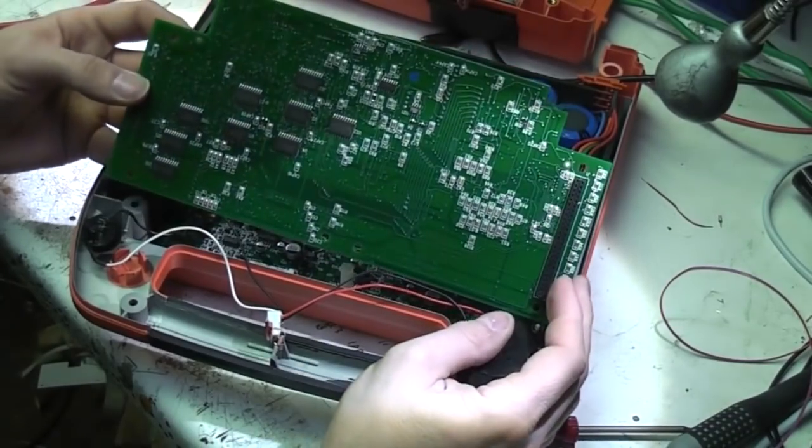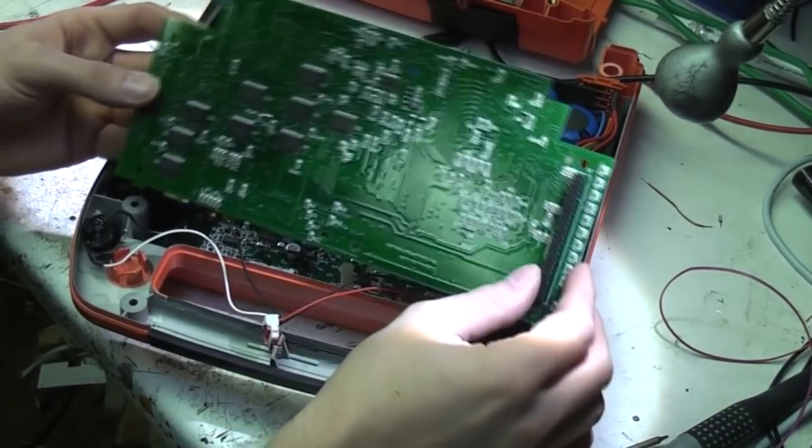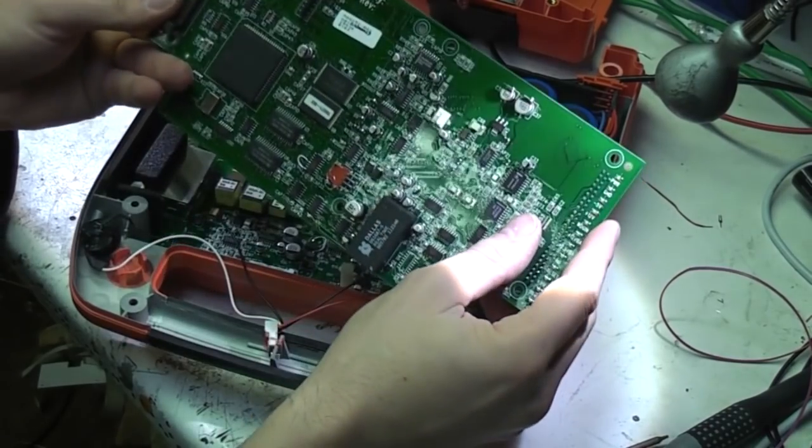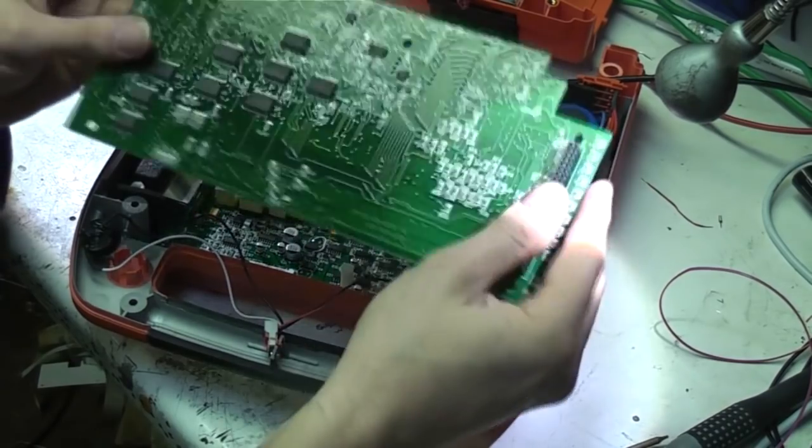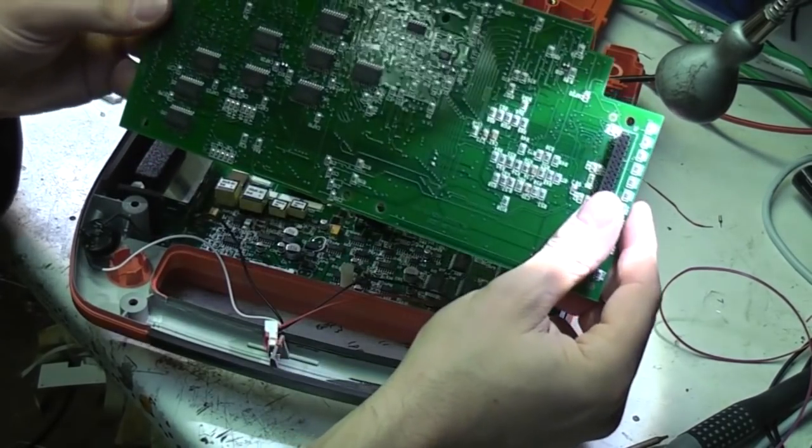Not much to see on the other side of this board. Just a few bus buffers, resistors, not much else. It looks like it's about a six layer board. You can see quite a lot of traces on a secondary layer in there and there'll probably be some power planes going through the middle.